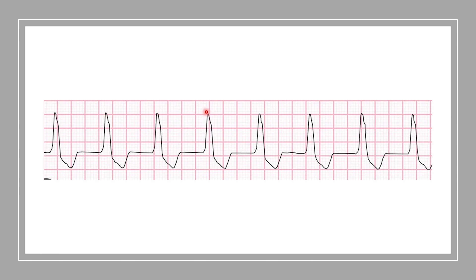Starting here and moving over to the next beat, we have about 3.6 boxes, giving us a heart rate at about 83 beats per minute. An idioventricular rhythm is around 20 to 40 beats per minute, and 40 to 100 is an accelerated idioventricular rhythm. So this would actually be an accelerated idioventricular rhythm.